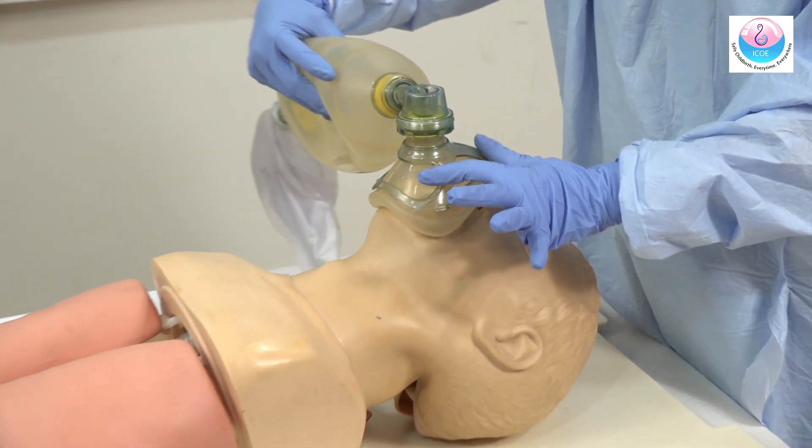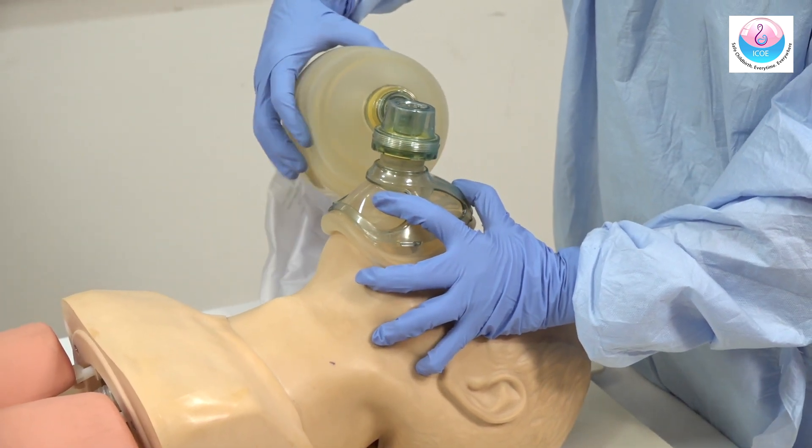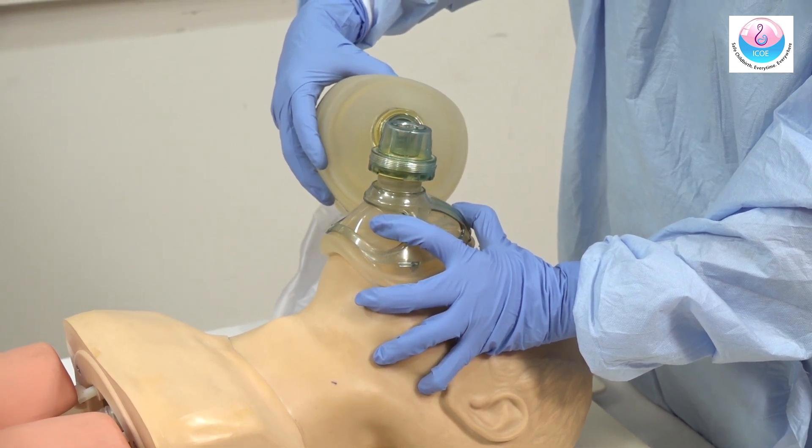You can use the Ambu bag for the rescue breath. Place the mask securely over the nose and mouth while maintaining head tilt. Ensure no leak. Compress the bag to deliver air at one breath every five seconds.